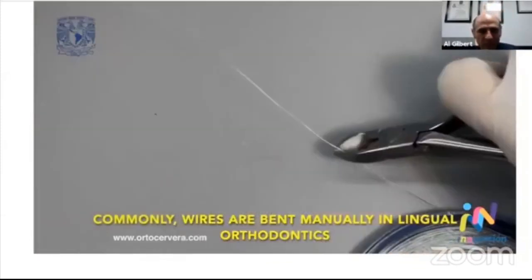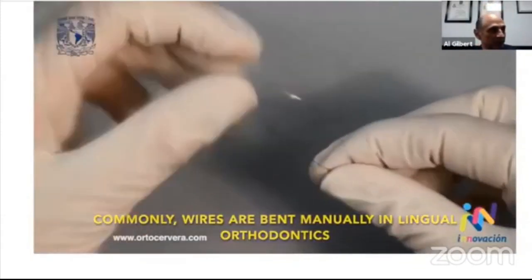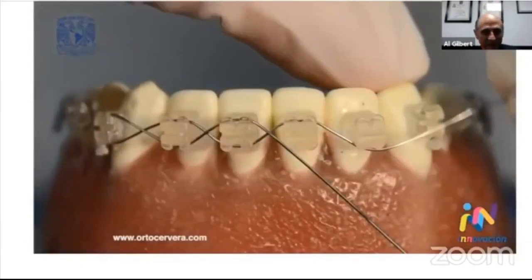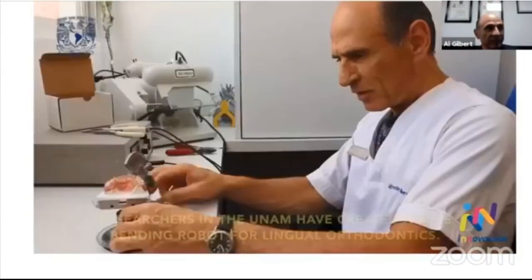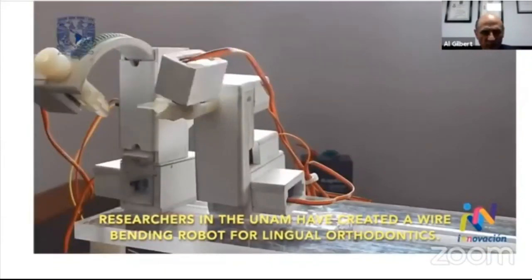Comúnmente, los alambres utilizados en ortodoncia se doblan manualmente. Investigadores de la UNAM crearon un robot doblador de alambres de ortodoncia.